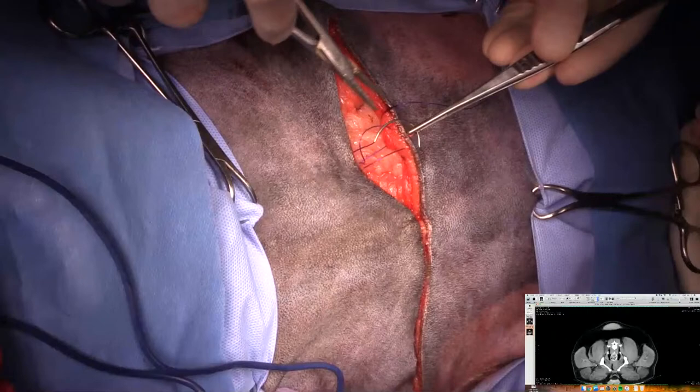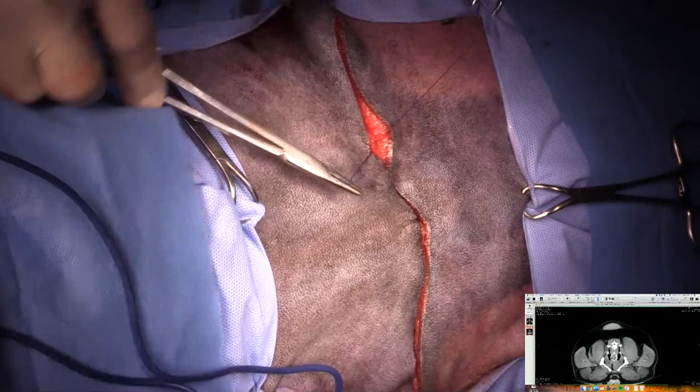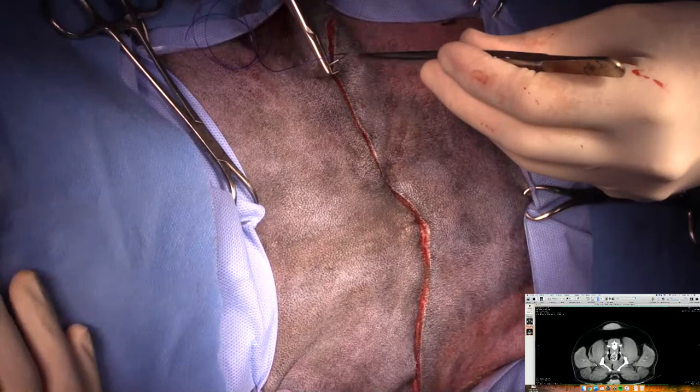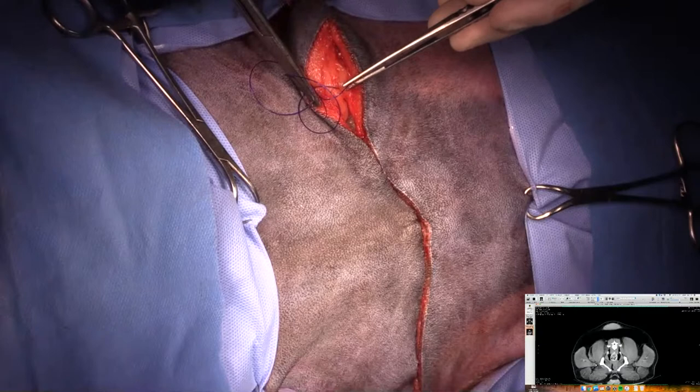Because there's no discharge here or anything, I'm not going to do a drain. You guys that watch us often would know that I don't like drains unless we really need it. In terms of the dead space for seroma formation, Charles, would you consider tacking it down rather than leaving a drain? That's a possibility. Yeah, but with the skin under tension, it's going to be hard to tack down. And we might get a seroma here, but that's not catastrophic either. I'd rather get a seroma than an infected seroma by putting a drain in. The drain's not going to stay in that long anyway.